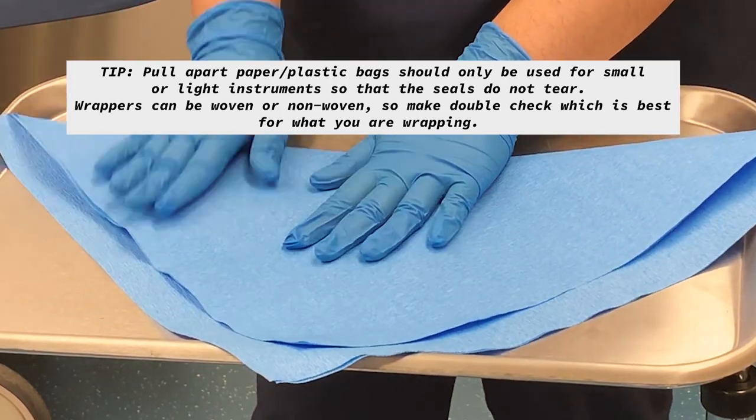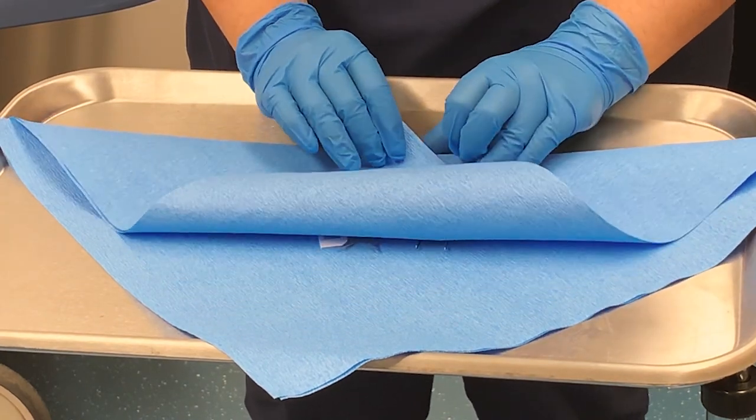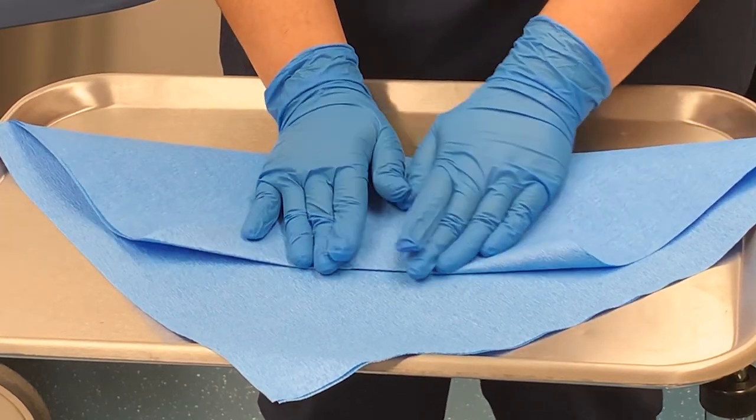Next, you're going to grab the paper and bring it down, making sure the top of your instruments are still covered.